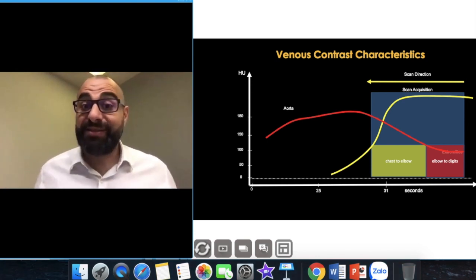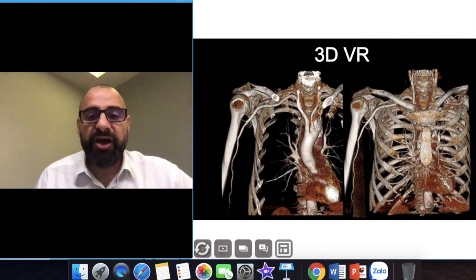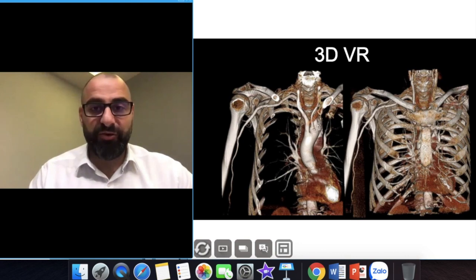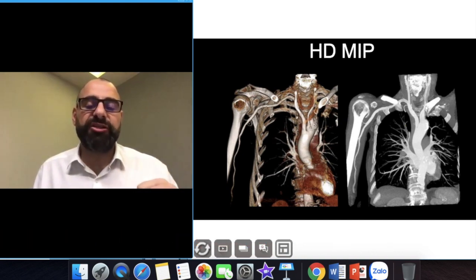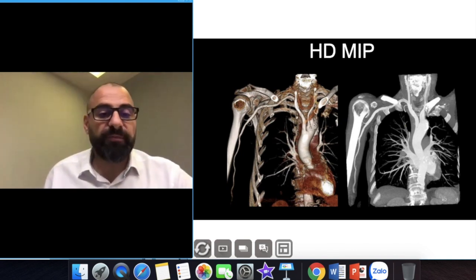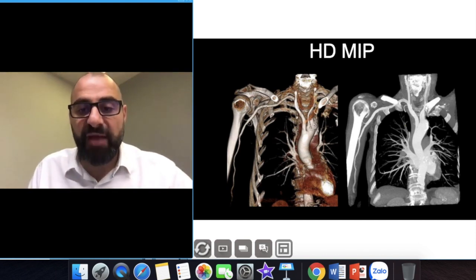Here's a typical patient for a subclavian angiogram. Notice how nicely you don't see the SVC artifact — because we used the thoracic CTA formula and protocol discussed two lectures ago. When presenting the information, this study was done to look for any obstruction between the clavicle and the first rib, which we call outlet obstruction. In this case there was good flow.